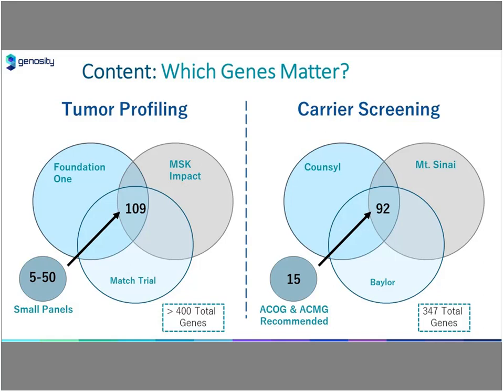And the same thing on carrier screening. Today there's no commercial off-the-shelf products for labs to go and start carrier screening. All of the projects that I've been involved with have been a custom design, sitting down, looking at all the panels, looking at the literature, and trying to develop the content. And even here we see that the intersection is quite small. And so this becomes a challenge.